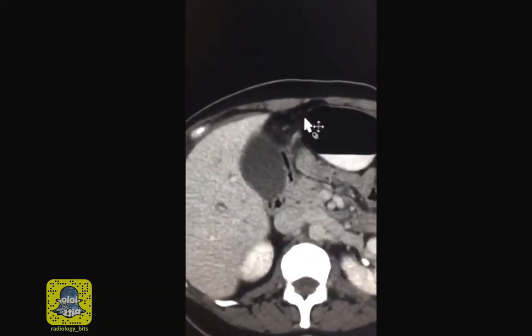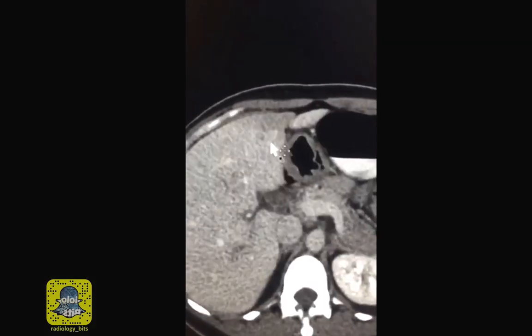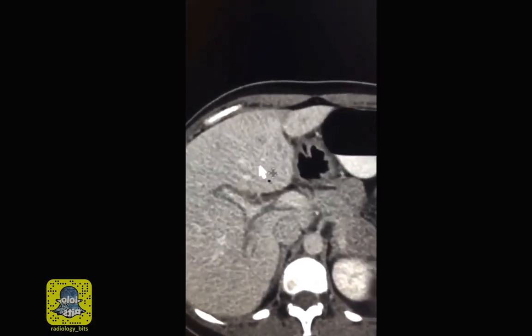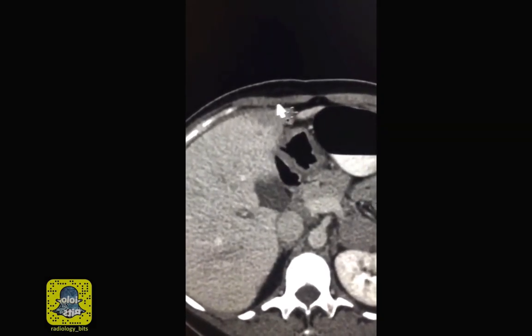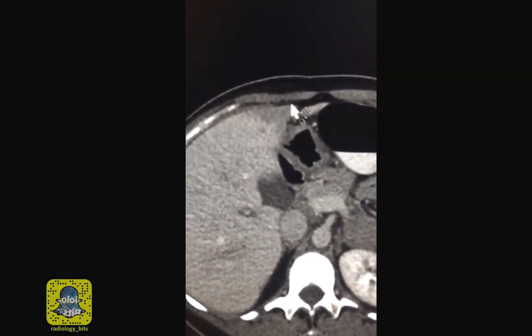So when you see this, remember that this is a very common appearance of focal fat infiltration of segment 4. Fat infiltration may be focal, multifocal, or diffuse — but remember this is a common appearance and location.